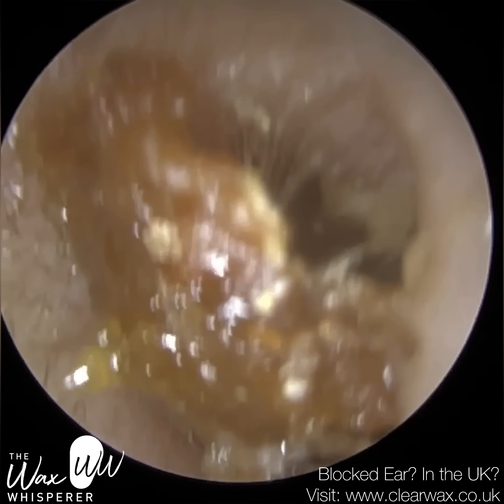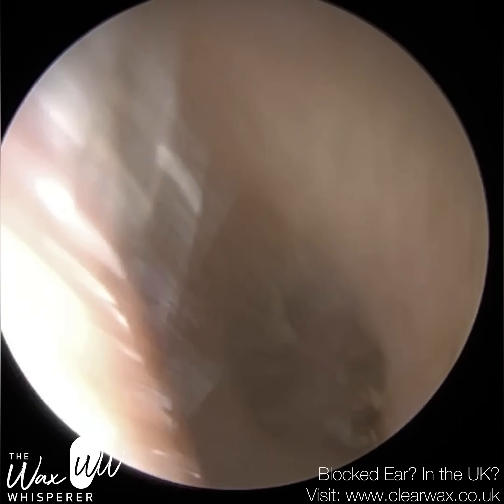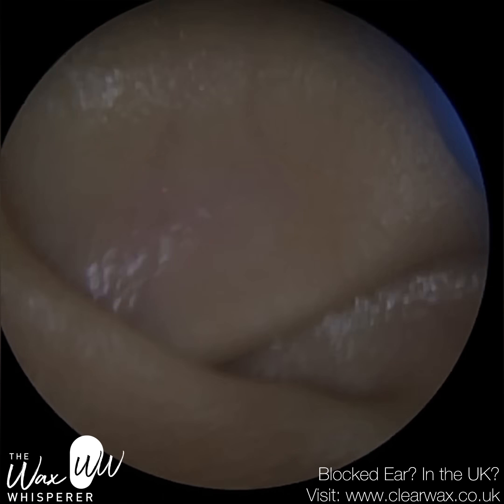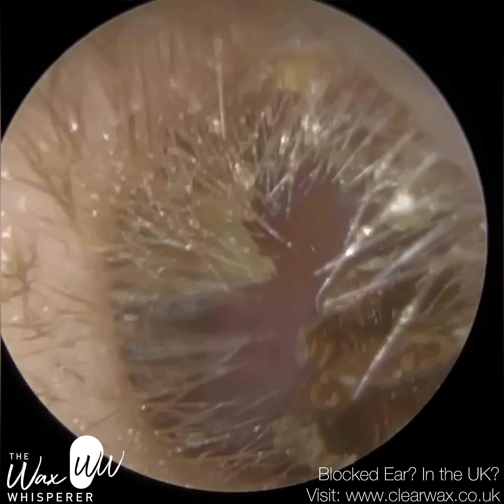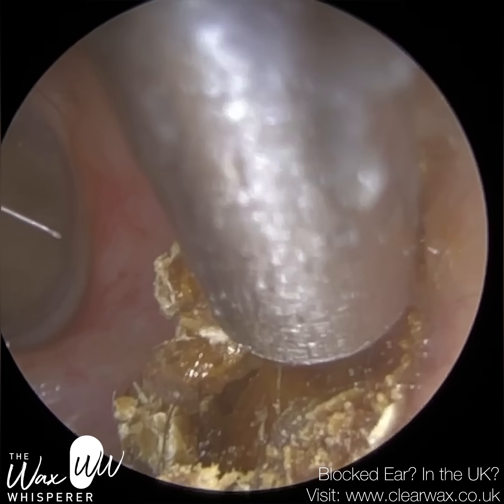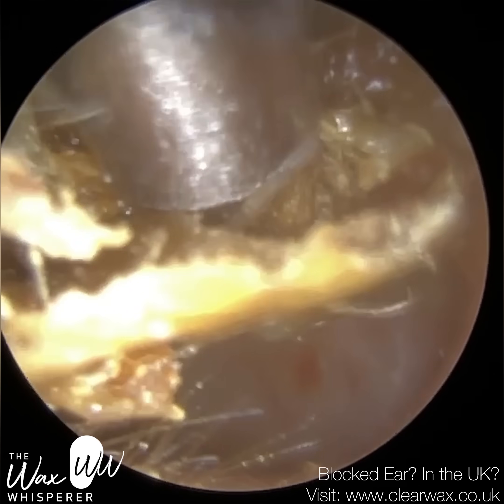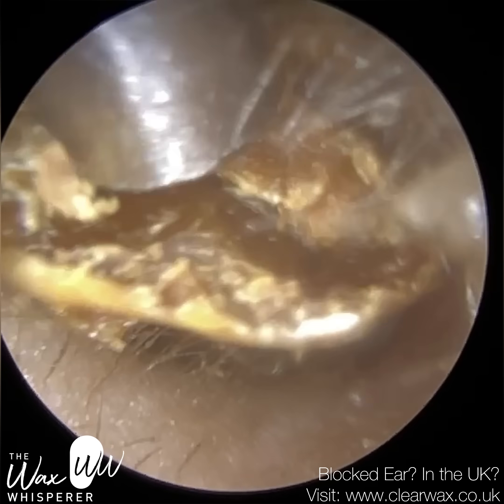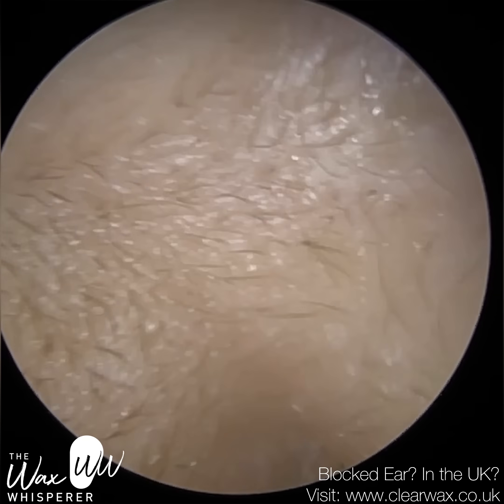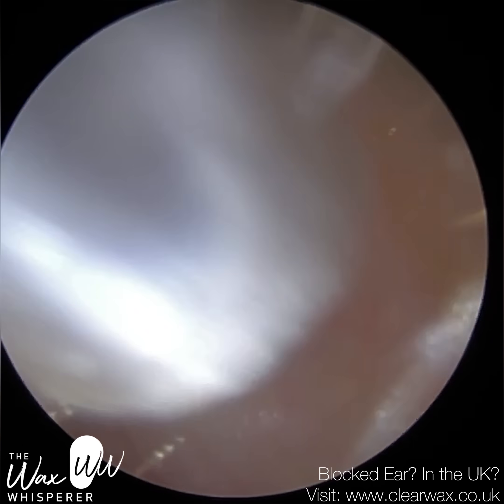Grade two is when there's more obvious expansion of the ear canal, the patient has ear pain, and they will be really complaining about their hearing. Grade three is when there's moderate expansion of the ear canal and there's also some granulation tissue present — some inflammatory tissue we call granulation tissue. It has a red, moist, bumpy appearance and is made up of connective tissue with its own blood supply.